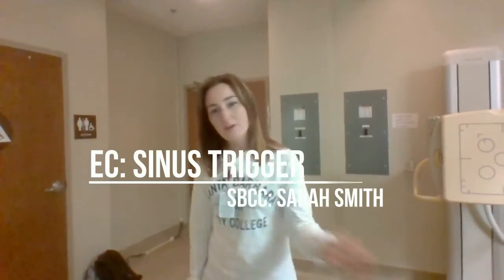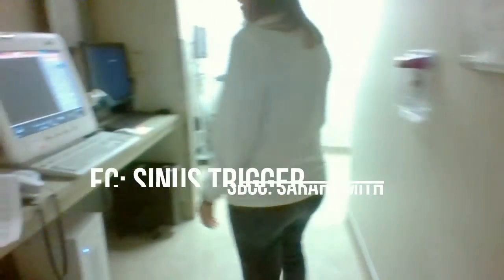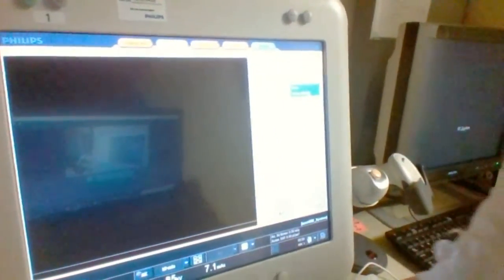My name's Sarah. I'm going to be filming my sinus trigger. Come on over this way and I'll show you these panels we have here. It's set up for my patient, and I can switch hands that way.